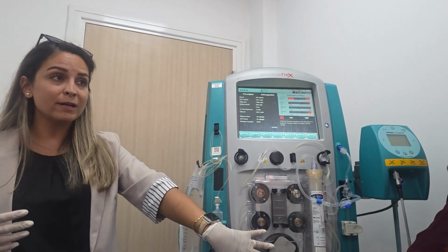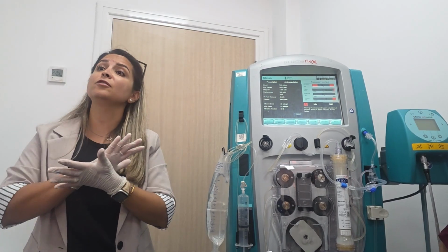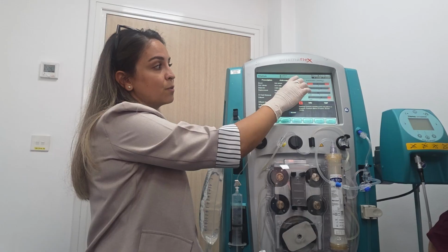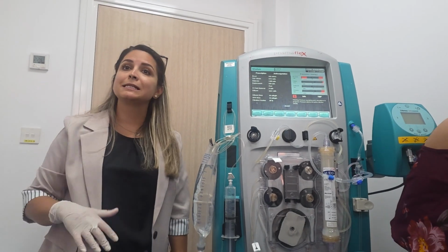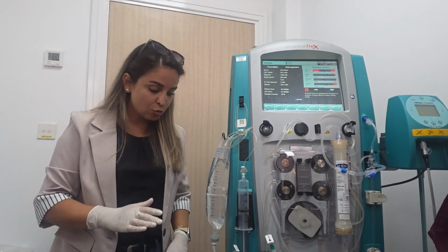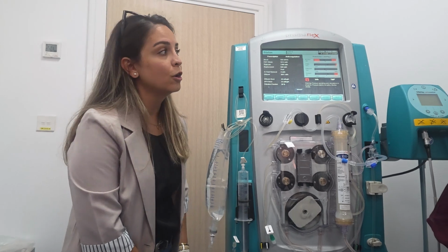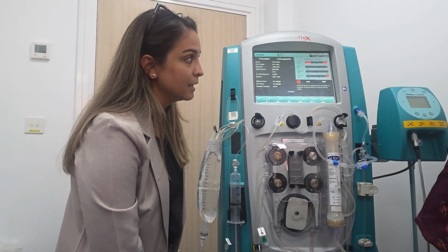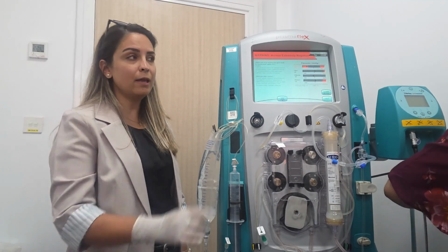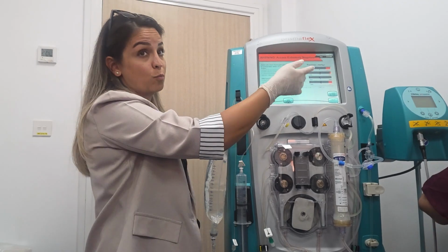So now blood flow is higher and still the numbers are below 100, it means the flow from the catheter is very good. If you see numbers more than 100, still accepted, but they should not reach 200. 200 means there is a problem from the catheter, clot or kinking. See? Now I will have an alarm. 200. Access extremely negative, it's minus 200 or more.